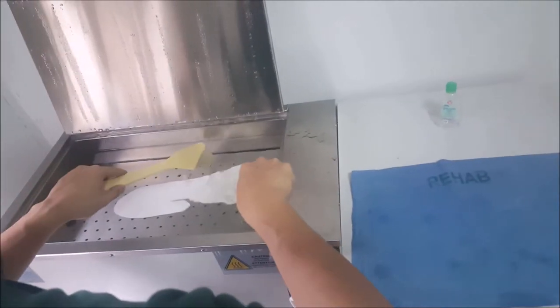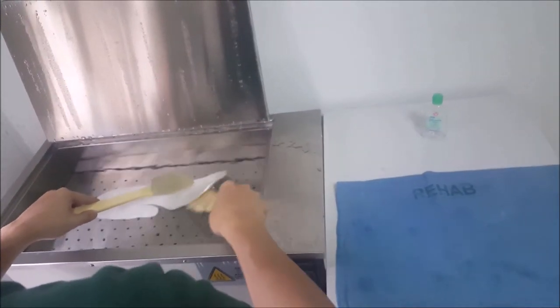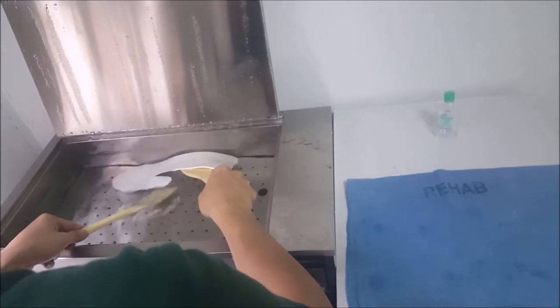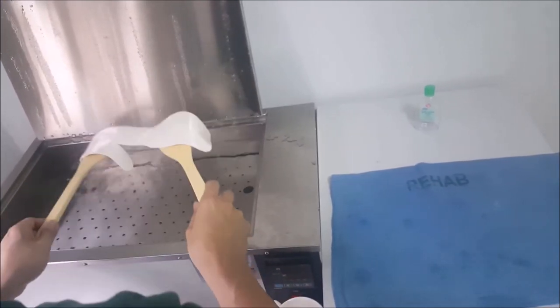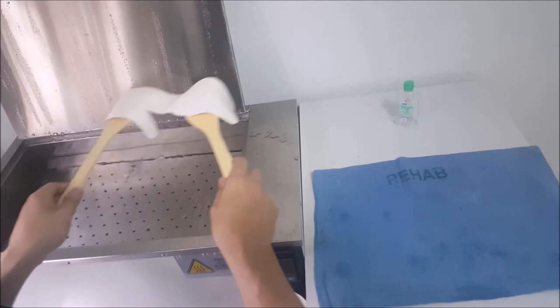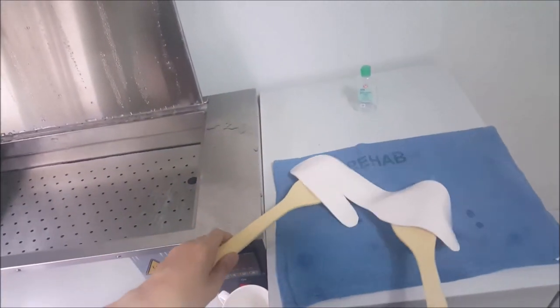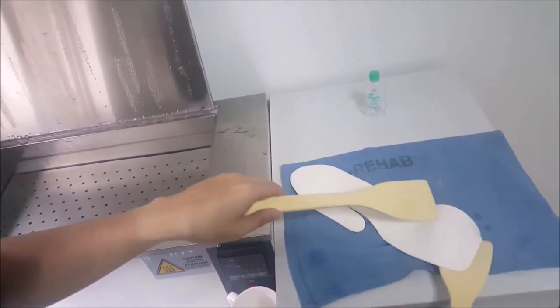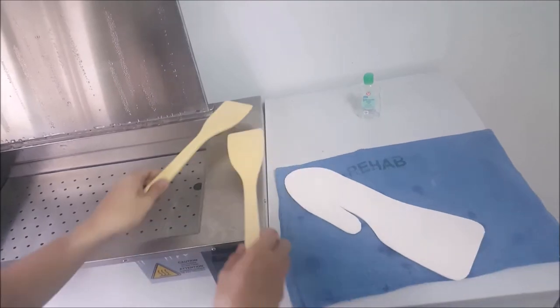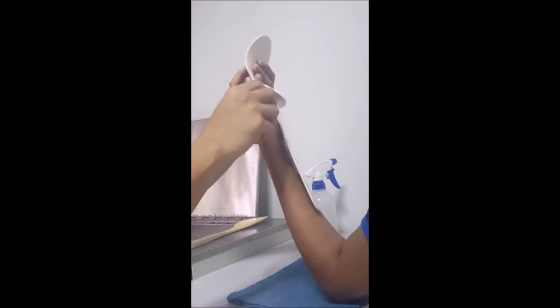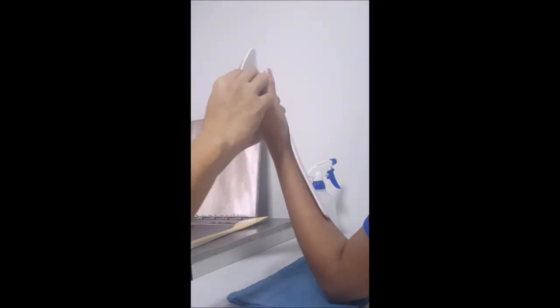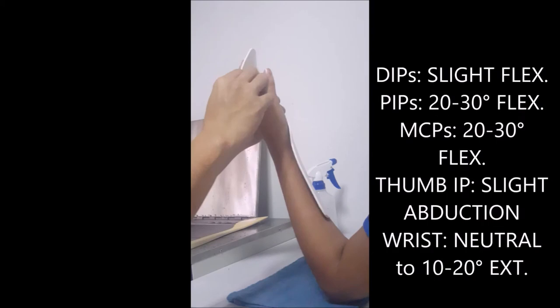Molding: In getting the thermoplastic out, you may use a splint strainer or flat spatula to avoid stretching it and making unnecessary marks. Position the patient's hand and place the thermoplastic. Please see the screen for the specific joint positions.